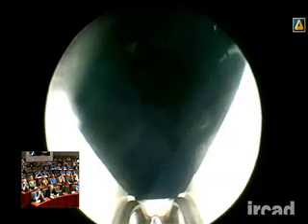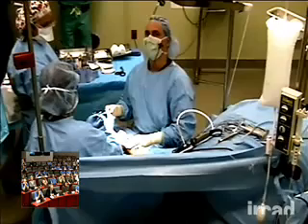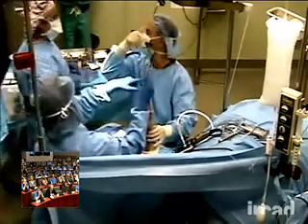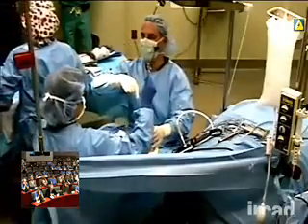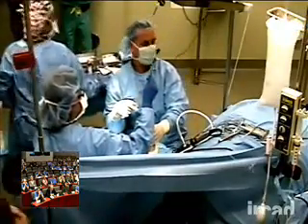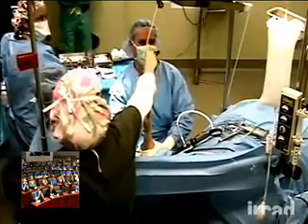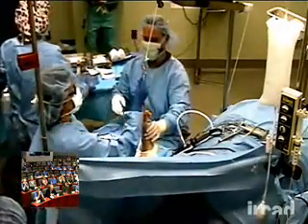Okay, now wall cam, so they see the suspension. Go to wall cam. And close later. Rosie, we need to hook down. What kind of traction do you use? We use 5 pounds of traction. Okay. You got it done?